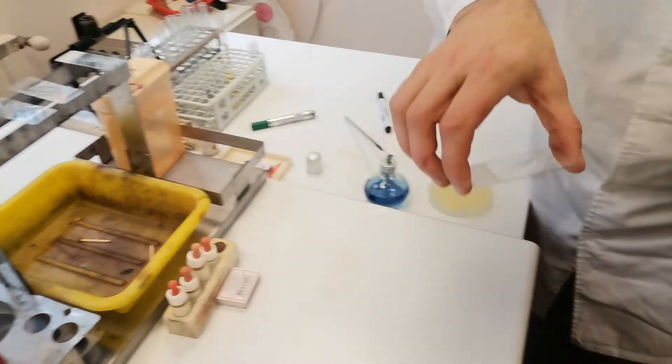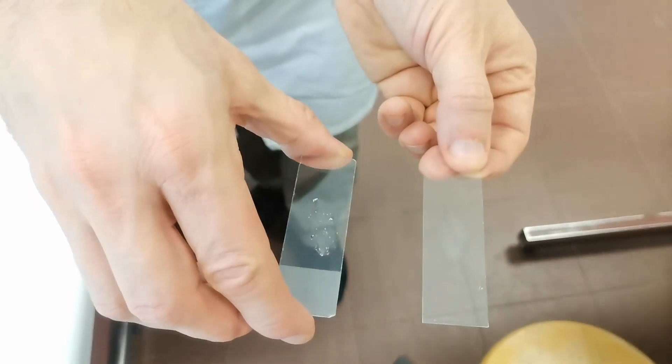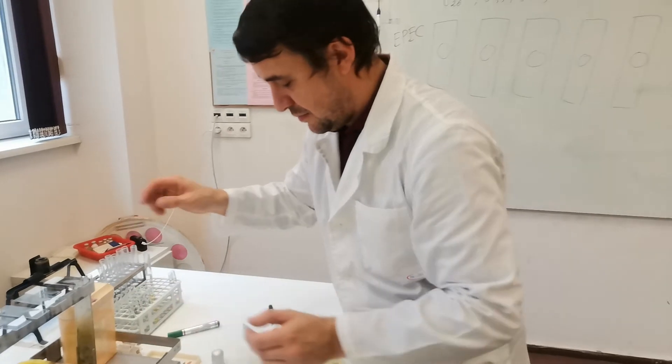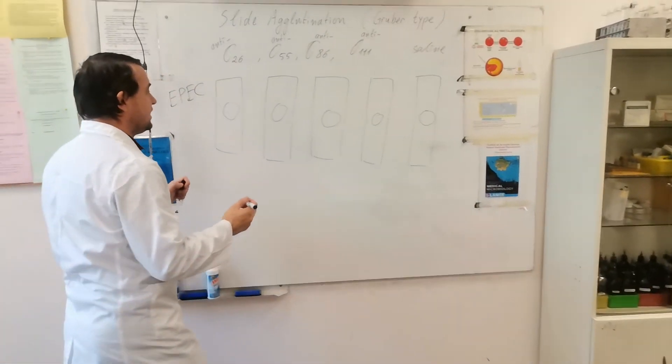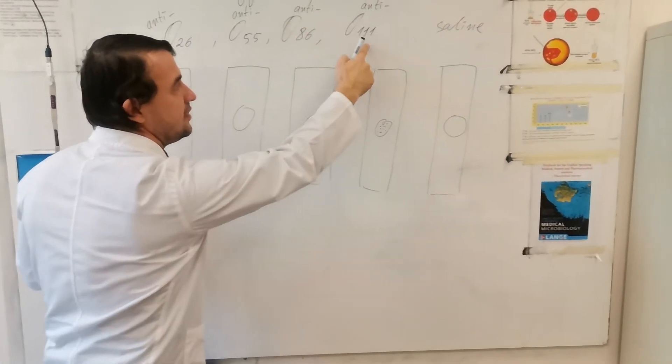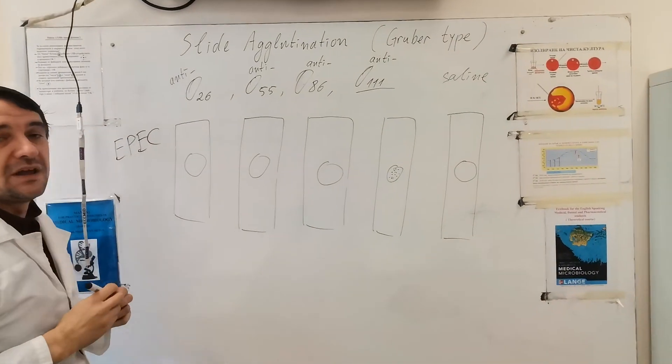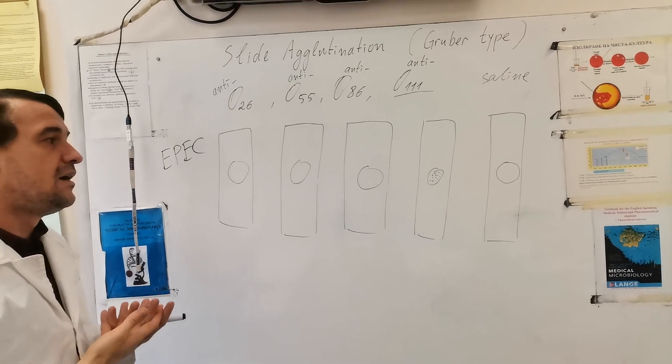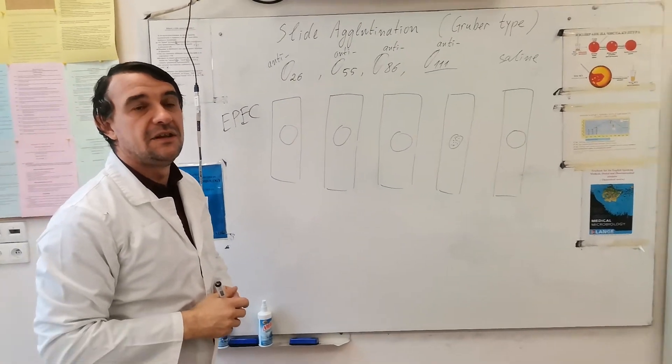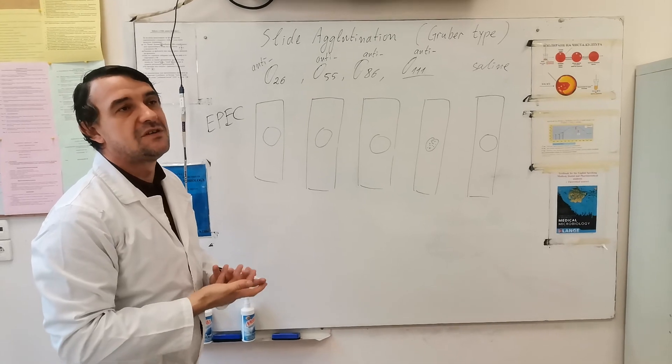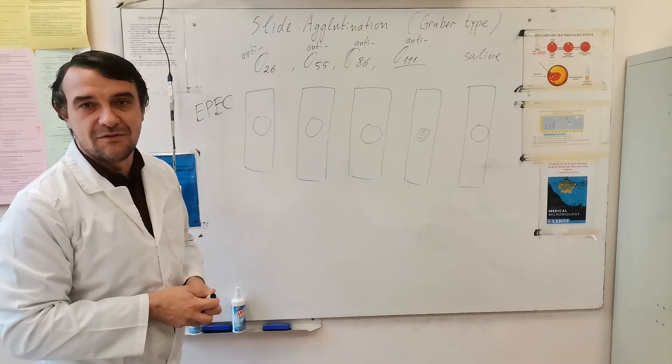Once again let's show you the difference between a negative and a positive reaction. You saw this Gruber type of agglutination within just several seconds. Here we have the fine grains only here in the drop with the serum against O111. That means our serotype of E. coli has been O111 and it should be reported as an enteropathogenic strain. The respective measures and therapy should be started. Thank you very much for your attention.